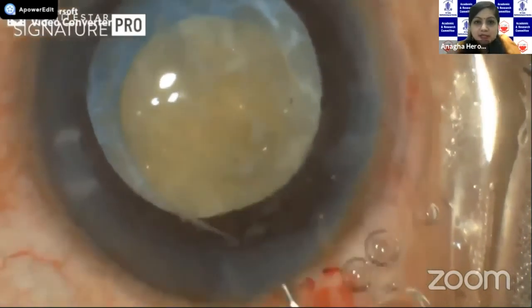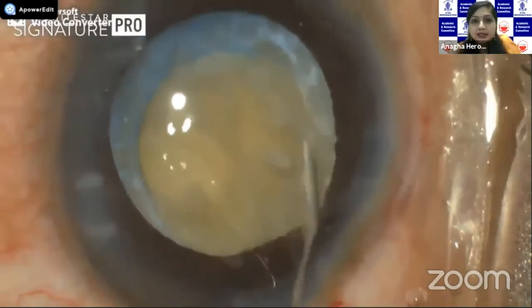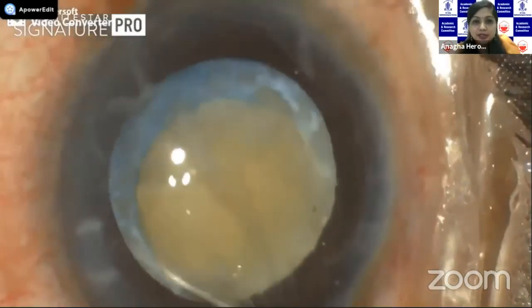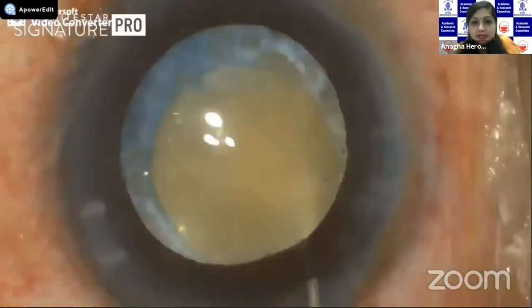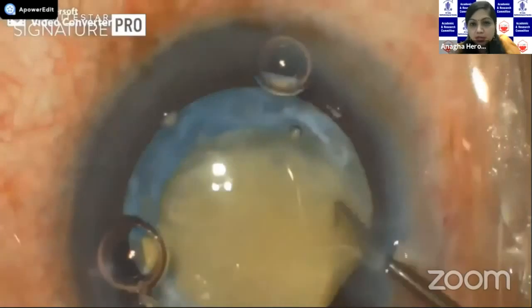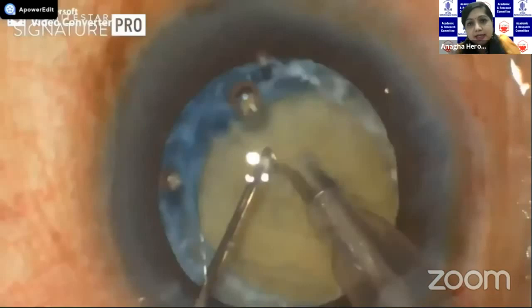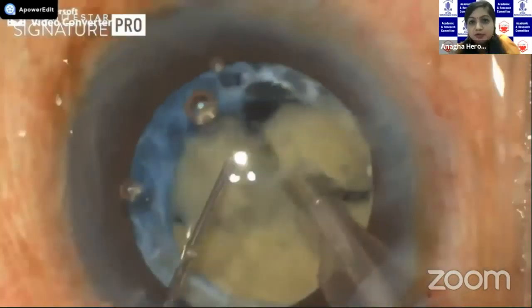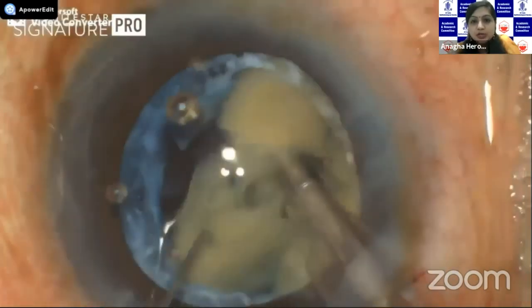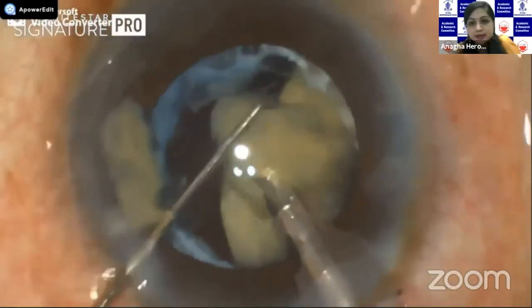Underneath was a relatively small but hard nucleus, which was freely mobile. In these cases, the integrity of the anterior capsular rim is what would win you half the battle. So we used a dispersive viscoelastic to protect the corneal endothelium and went ahead with the chopping technique. In these cases, chopping can be a little tricky because there is no cushion at all of the epinucleus or of the cortex. So you need to have very good fluidics, good hold on the nucleus, and phaco at the capsular plane.